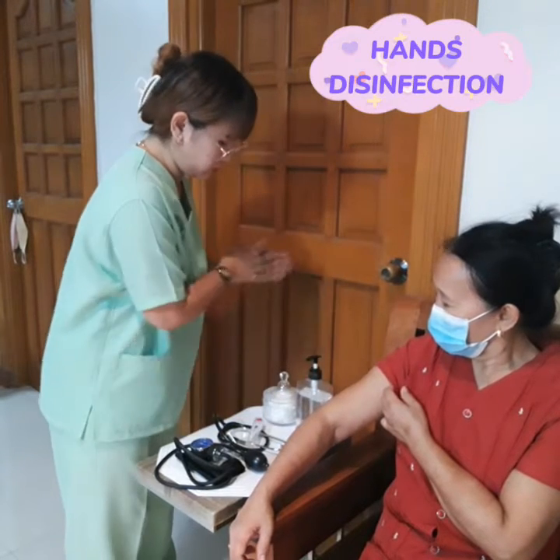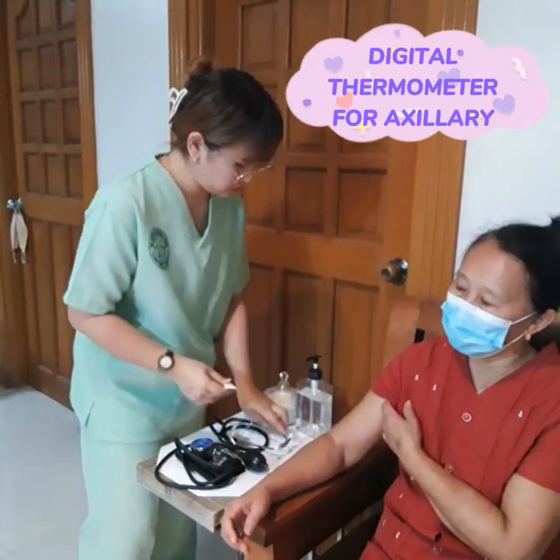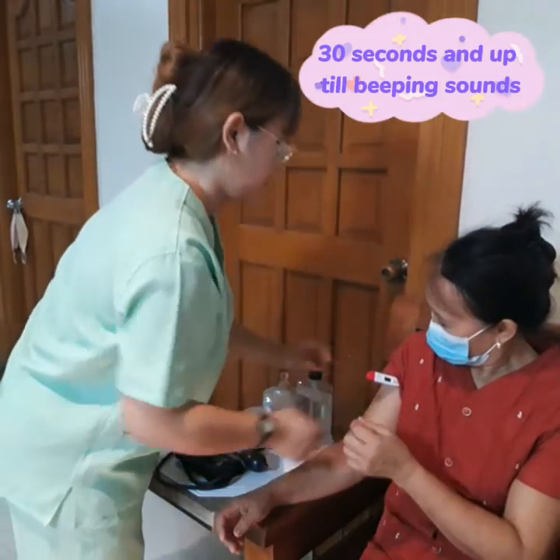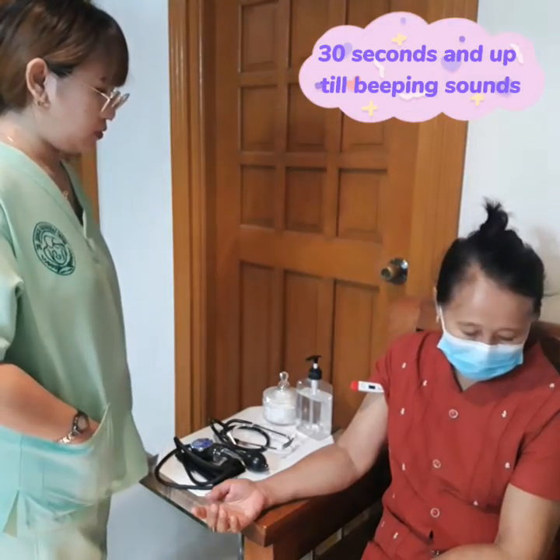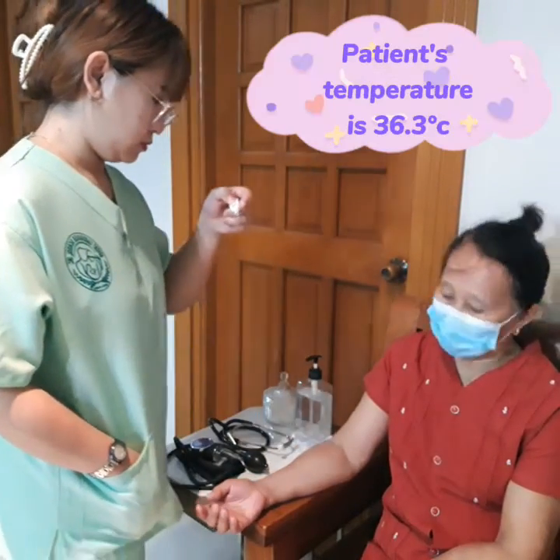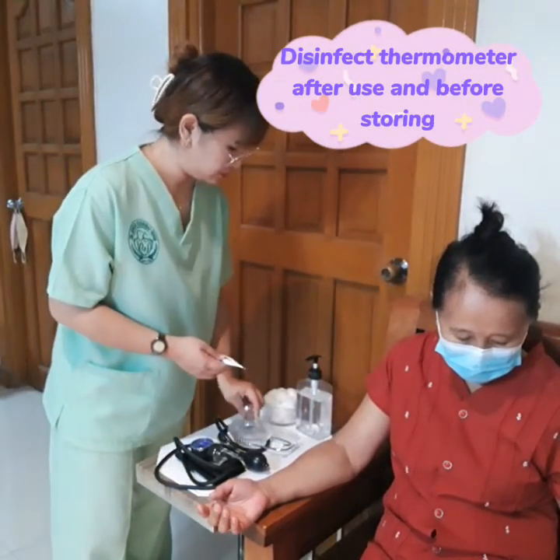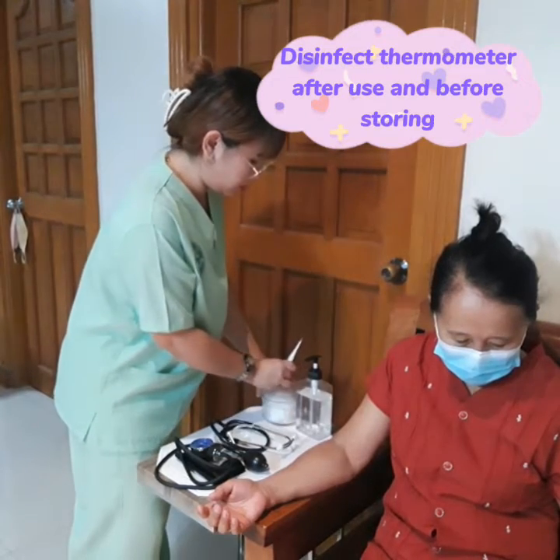Firstly, disinfect hands with rubbing alcohol. Now I'm going to use a digital thermometer to check the patient's temperature by her axillary. Wait for about 30 seconds, until you hear the thermometer's beeping sound. Now that you hear the beeping sound, check the result and let the patient know her temperature result. Now after using the thermometer, use some cotton balls and alcohol to disinfect before storing.